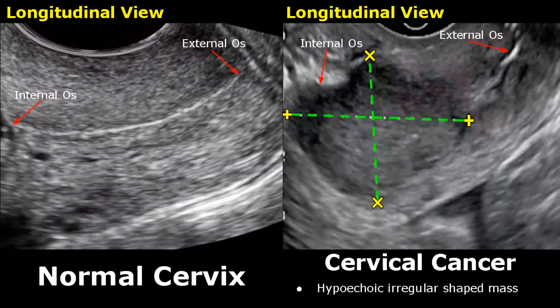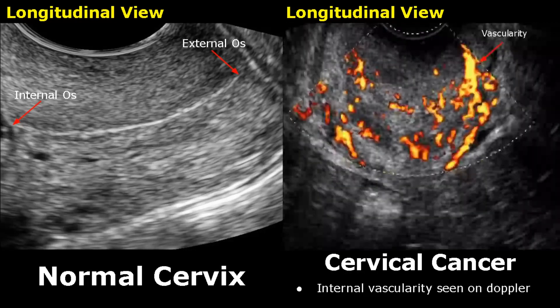Cervical cancer is also difficult to see on ultrasound and sonography is not reliable for it. If the mass is large enough, we may see an irregularly shaped hypoechoic mass in the cervix. On Doppler, this mass will have internal vascularity. Here, power Doppler is used and we can see many areas of vascularity.